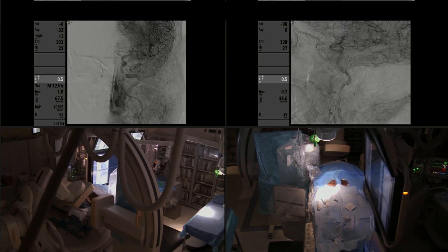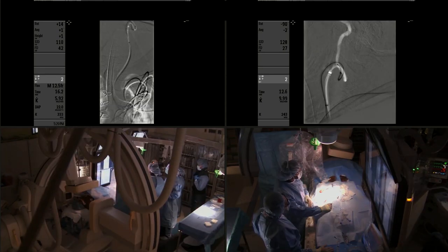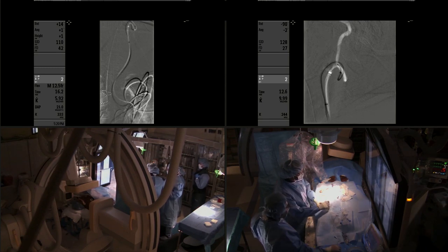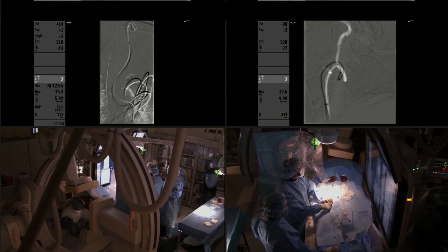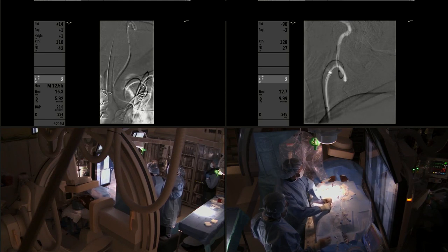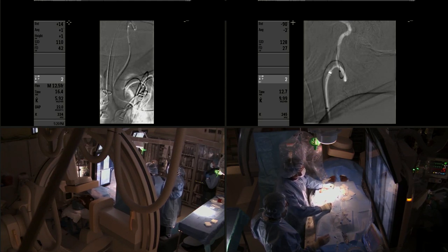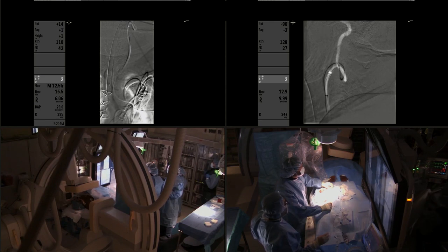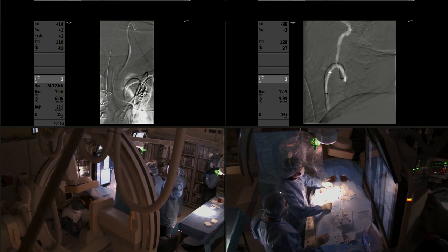This is the digital subtraction angiogram in AP and lateral views showing the severe stenosis of 90%. Her anatomy was very tortuous. We required the use of a NeuronMax as a guiding sheath, which was advanced over a 5 French VTEC catheter into the left common carotid artery, followed by an intermediate catheter.